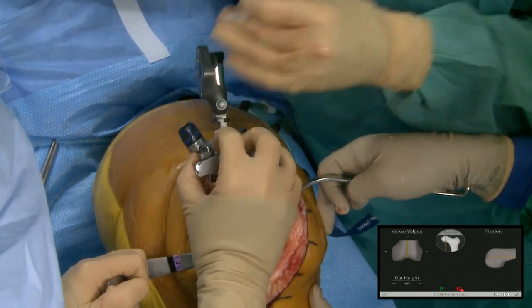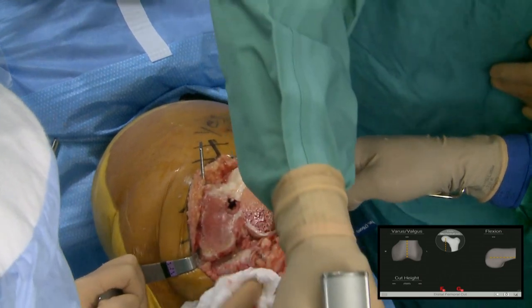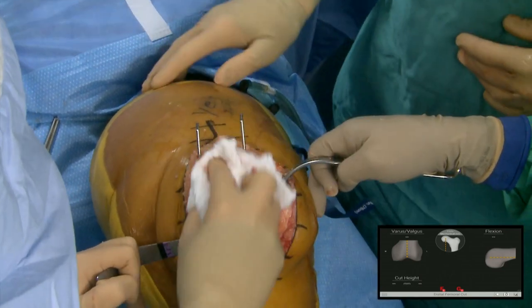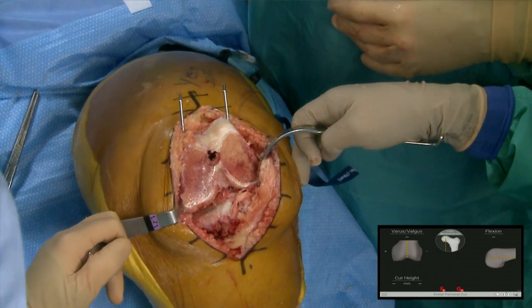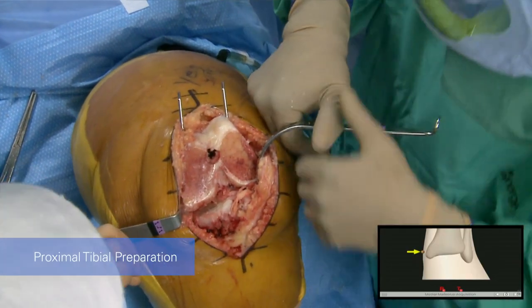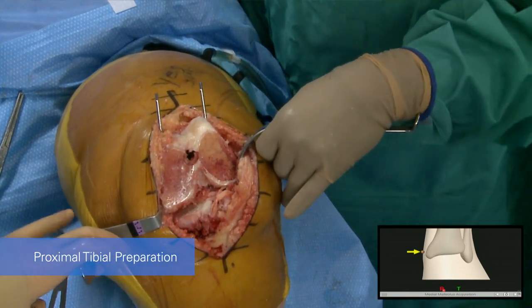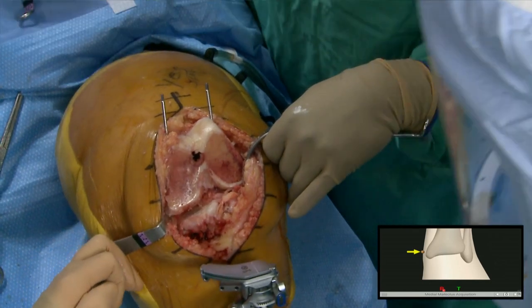I'm taking out the threaded headed pins but leaving the smooth pins in, because I still don't know about the gap. If I have to come back and cut the distal femur, the pins are in place to do that. Now I'm advancing to the tibial screen, and with the machine in the field I was able to advance that just by touching the screen.